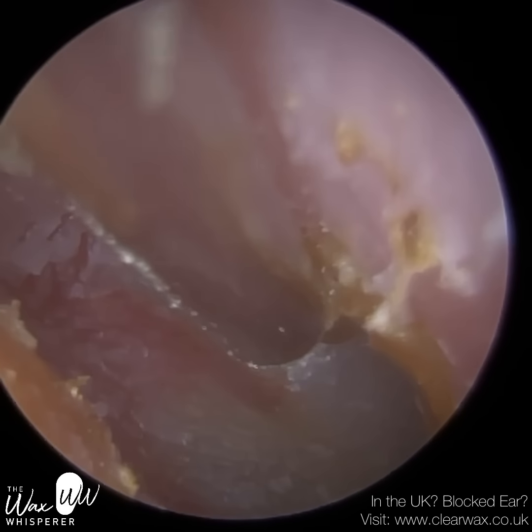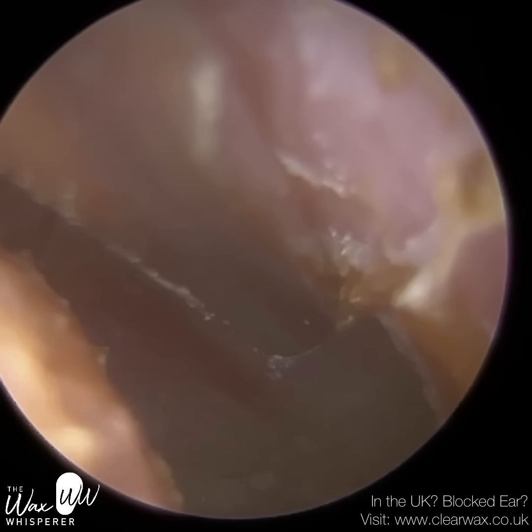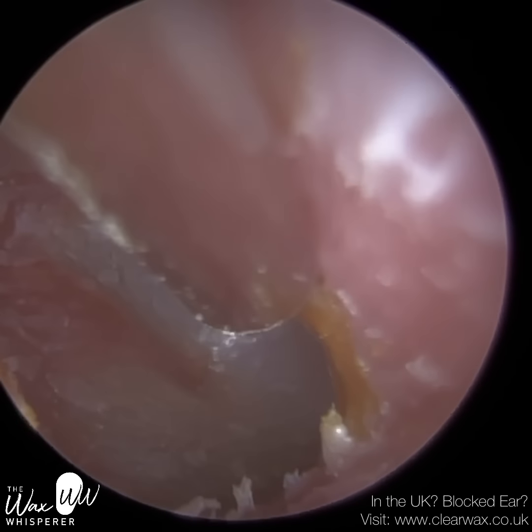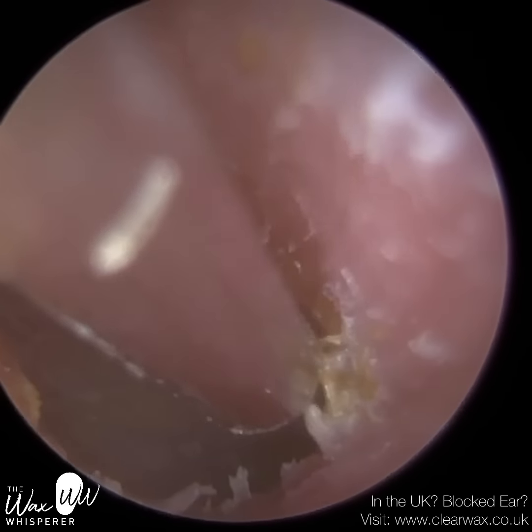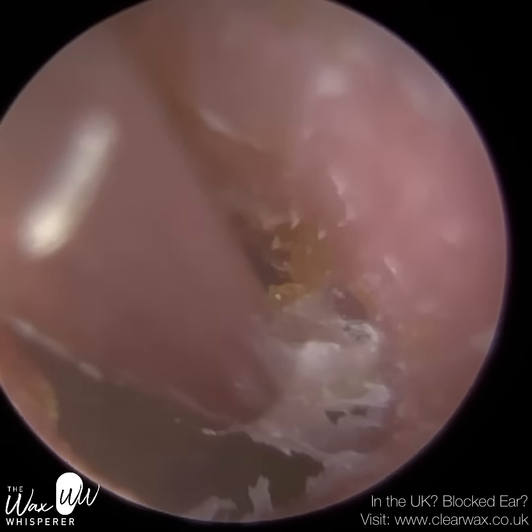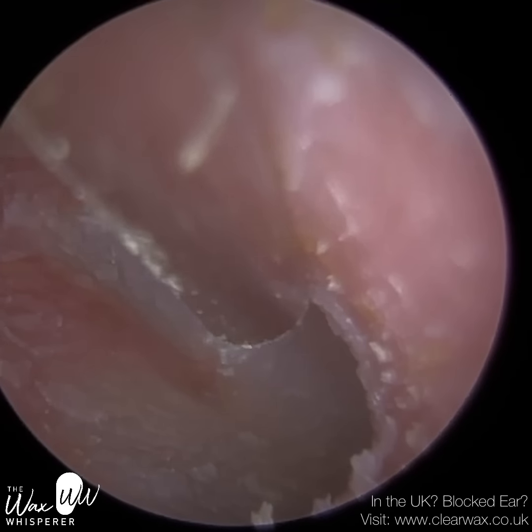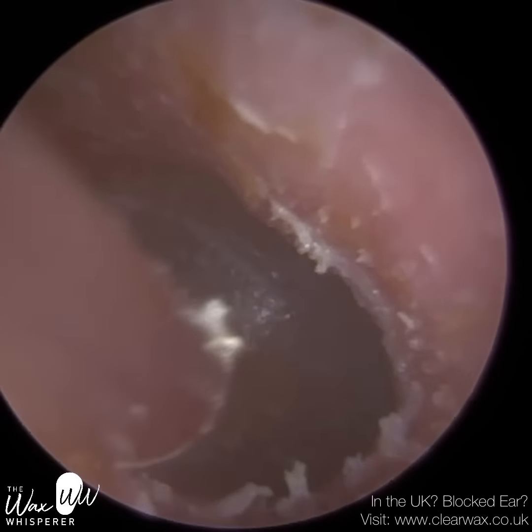Just at the front part of the ear, on the bony part, so this is the sensitive part, we're going to be really careful. We don't want to come in contact with that part of the ear canal, just hovering over, because that will be uncomfortable for the patient. You can see we're just gliding this fine end over the top, slowly and away from the bone itself, just lifting it, always working away from the canal, so we're not making direct contact, and we're minimising the risk of causing trauma.